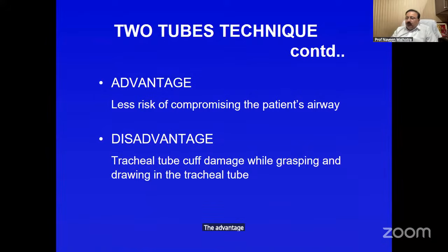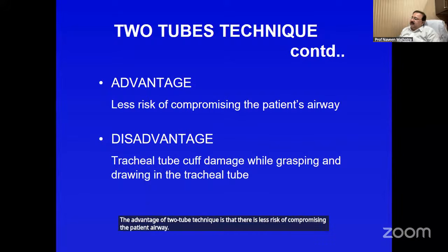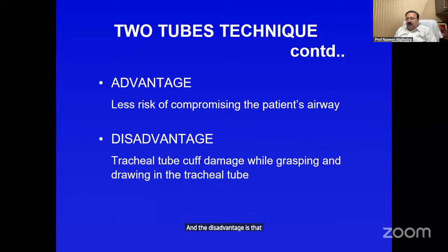The advantage of the two tube technique is that there is less risk of compromising the patient airway, and the disadvantage is that while drawing in the tube from outside, if we catch hold of the cuff, then the tracheal tube cuff can get damaged.